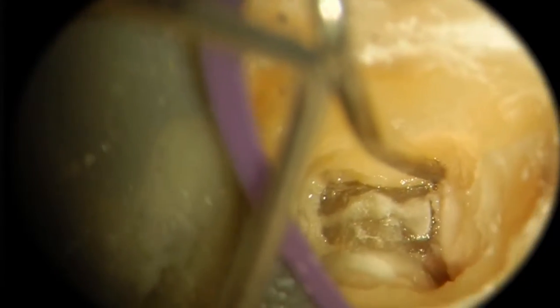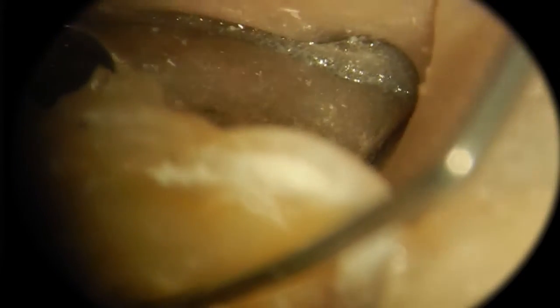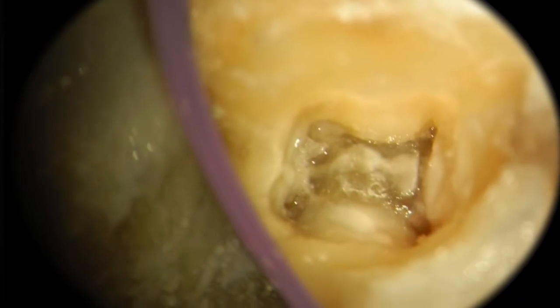And the width of the chamber and the distal makes us think that we probably, there it is, pretty much locked in, probably have ourselves 2 canals in this distal area here. And again, a stick like that is another very good probability that we got 4 canals right there.